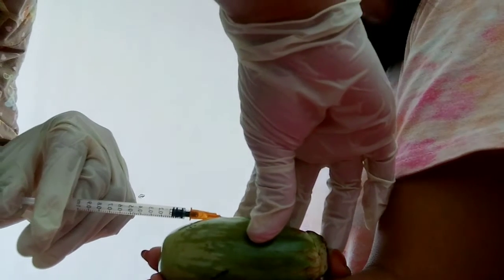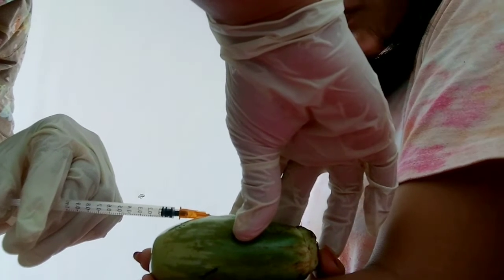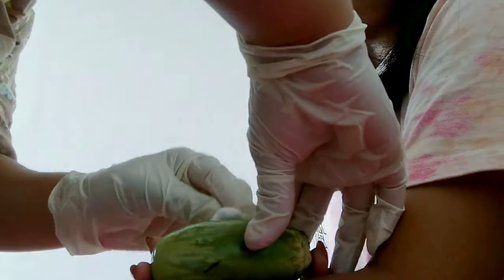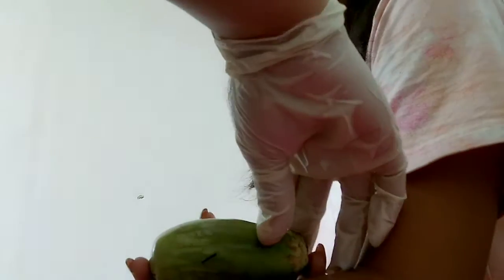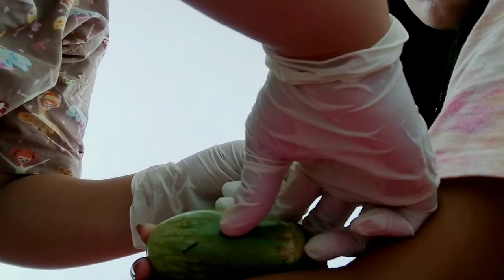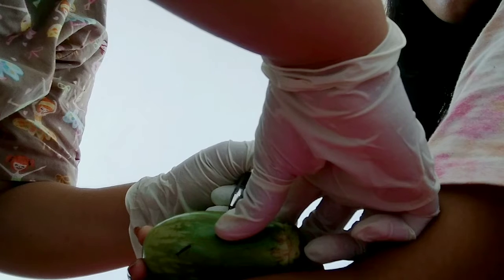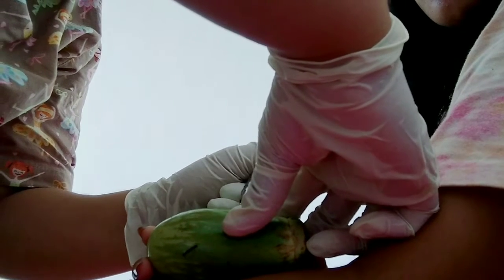If the bleb appears, withdraw the needle at the same angle to avoid tissue damage. Then pat dry with a cotton ball. Do not massage the area. Now encircle the wheal with a black or blue pen, and instruct the patient not to rub the area or erase the mark.